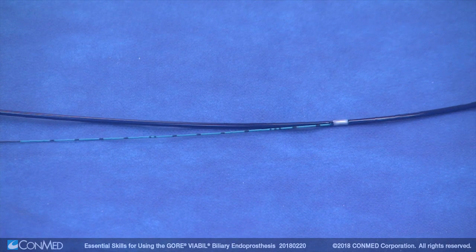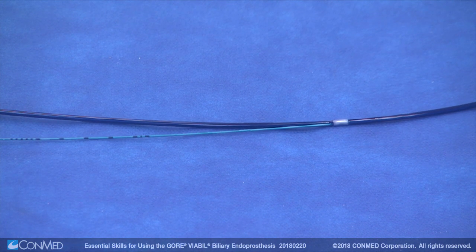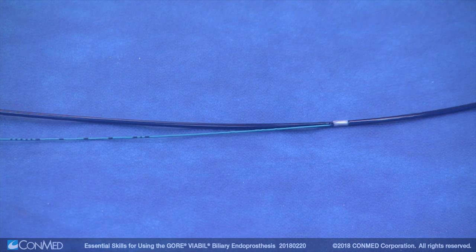On the catheter of the short wire device, there is a clearly identifiable exit ramp with a white marker that allows for easy short wire exchange. Here, the catheter becomes stiffer, allowing for greater pushability.